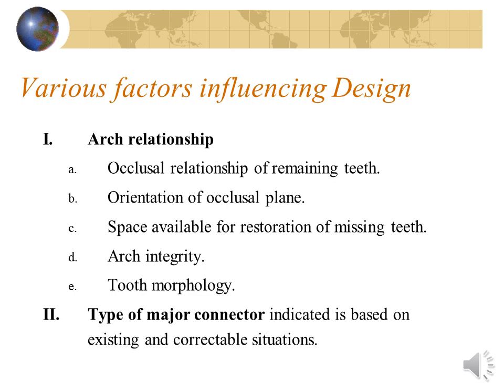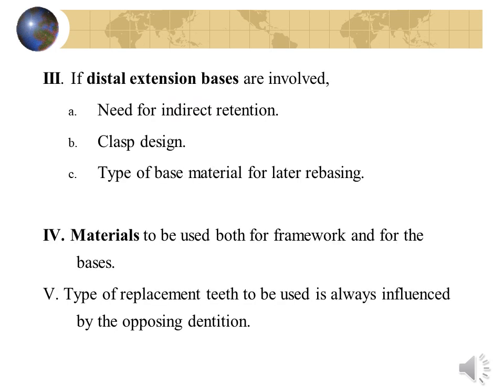Second, the type of major connector indicated is always based on existing and correctable oral situations. Third, if distal extension bases are involved, need for indirect retention, clasp design that will minimize forces directed towards abutment teeth, and the type of base material for later rebasing should be considered.